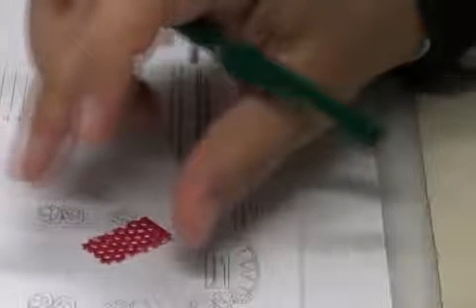We said it in the lecture. What is the best? Open lattice. Why is it the best? Retention of acrylic. With a mesh, the acrylic contacts the lower layer and upper layer through the holes. These holes are small, so we don't get the best retention. While with an open lattice design, we get large holes, and through these large holes acrylic can bind better from the upper layer to the lower layer.